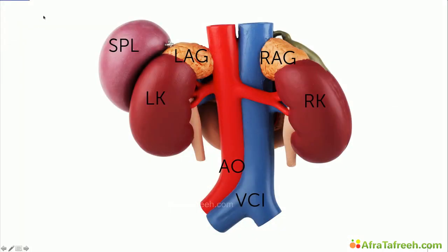We can see in a normal position, the liver is near the right kidney, and also the gallbladder is an adjacent structure. Now let's take a look at the kidneys from the dorsal side. Here we can see how close the kidneys are situated to the big vessels, the aorta over here and the IVC on the right side. We can clearly see the ureter forming out of the renal pelvis on the left side and on the right side, and we can also display the spleen near the left kidney over here.